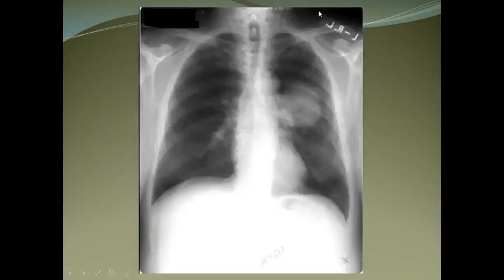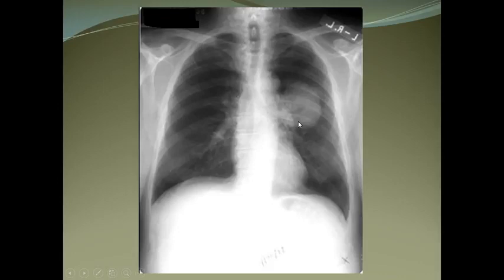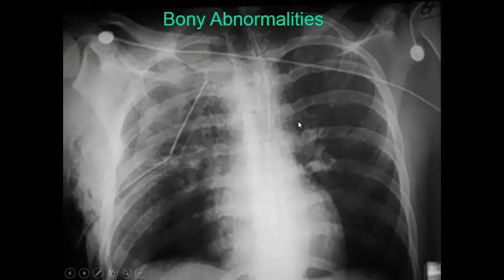A lung mass appears as a mass of tissue density in the lung fields — in this case in the left perihilar region. Bony abnormalities such as rib fractures can also be seen, along with subcutaneous emphysema and clavicle fractures.